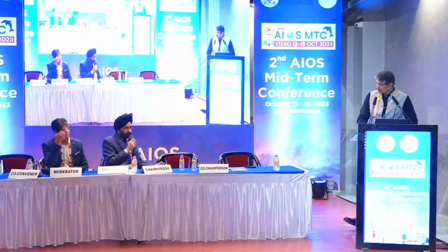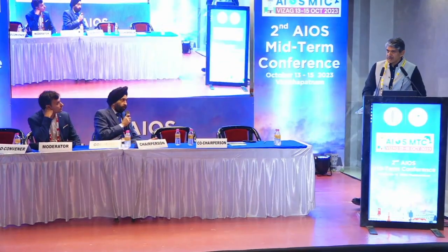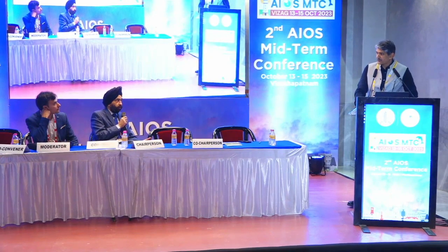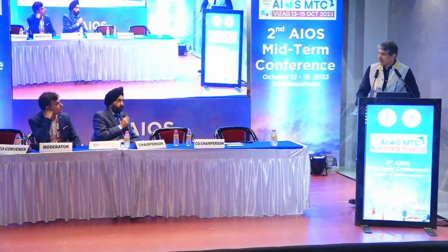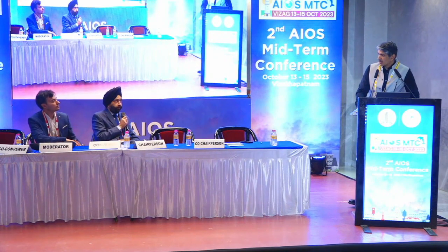Any questions for Dr. Sri Ganesh? So Shri, from the perspective of this particular machine, the marking is still required for cyclotorsion. Yeah, the 0 to 180 degree marking you have to do, but I think shortly in the next software upgrade, it will take the image from the IOL Master 700, so you have an automated cyclotorsion and a markerless system.